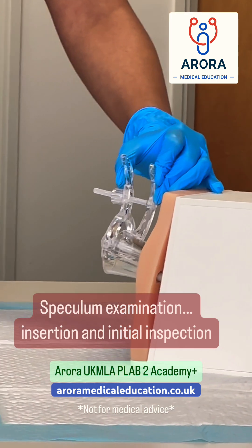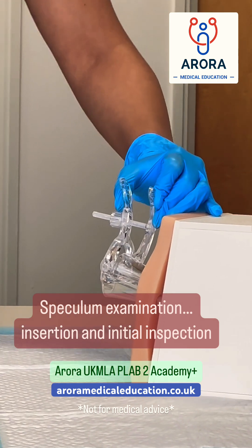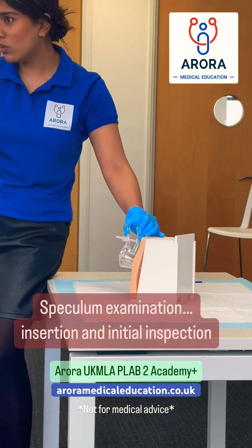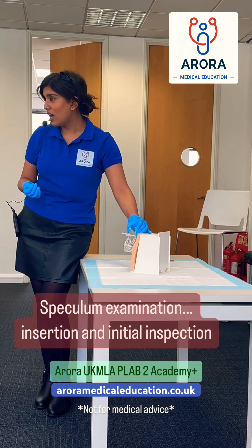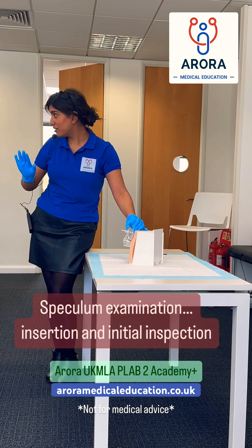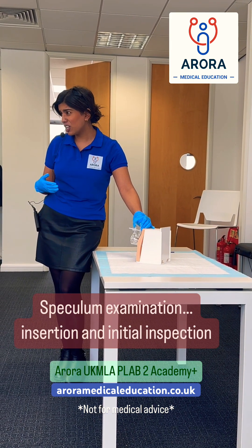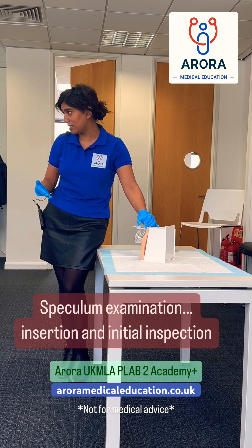Now, providing you've got a good light source, you can then look at the cervix. There's a couple of things that you're looking for at the cervix. What does the cervix look like? Is the cervix normal? Can you see any inflammation? Can you see any lesions? Can you see anything that might warrant further investigations?